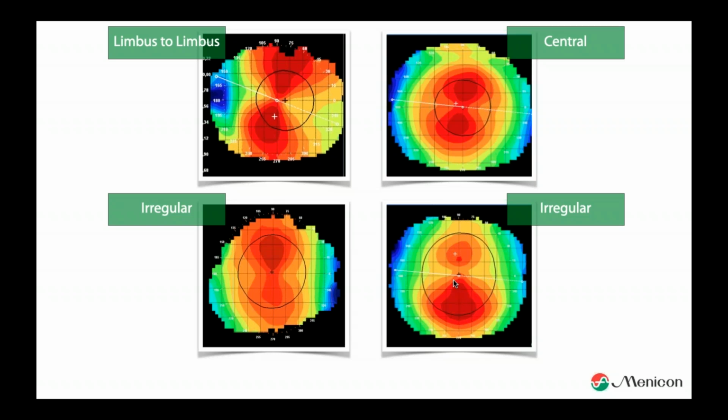Well, keep breathing. It's just an irregular astigmatism. When it starts to dent over here inside, then it is a keratoconus suspect. So as long as it isn't, just keep breathing, you have to deal with an irregular cornea, and move on with your lens fit.